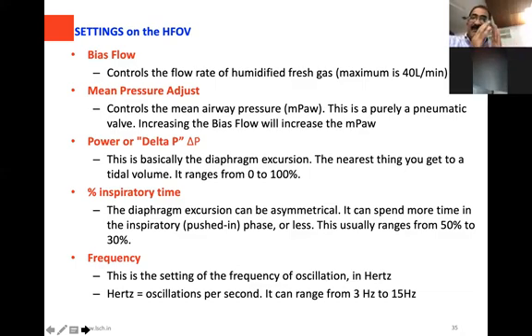So it's very, very important. It's like horses for courses. You need to know your machine well. You need to know yourself well. What are you comfortable with? What have you learned your oscillation on? So the important thing here is what oscillator you are used to and how the child is. It all depends that way.